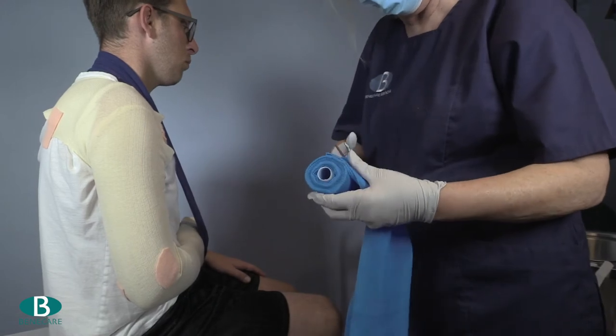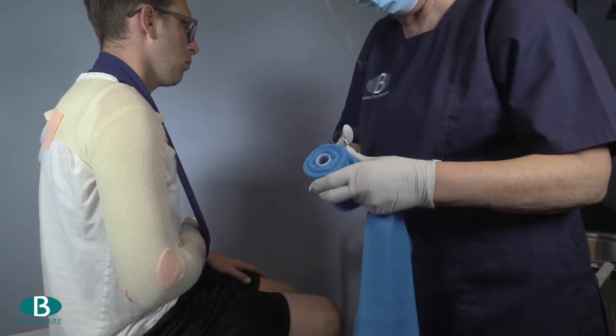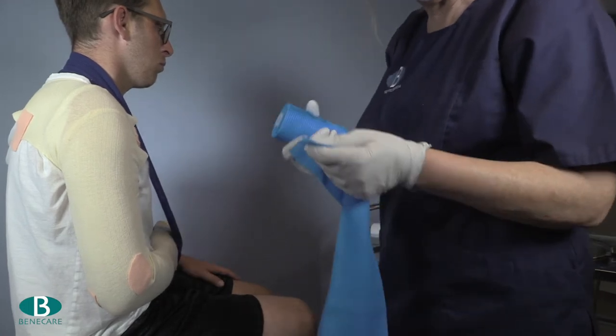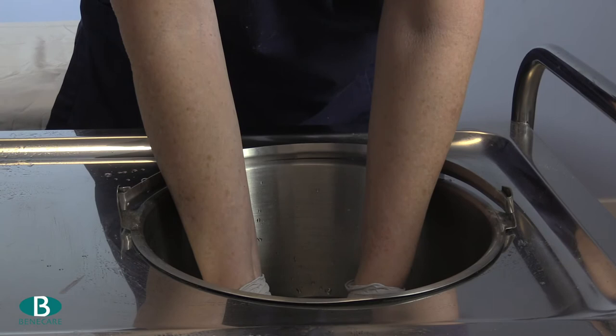Cut the slab and dip both the roll and the slab into room temperature water, providing a moderate squeeze to remove excess moisture.